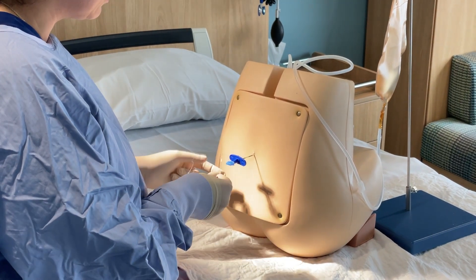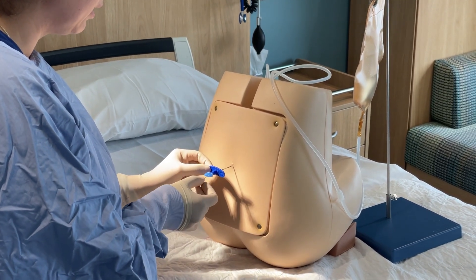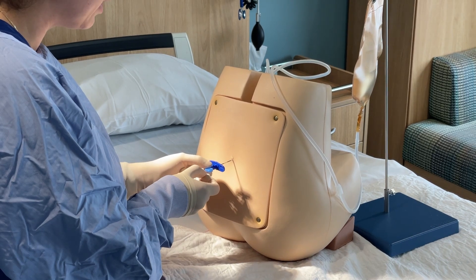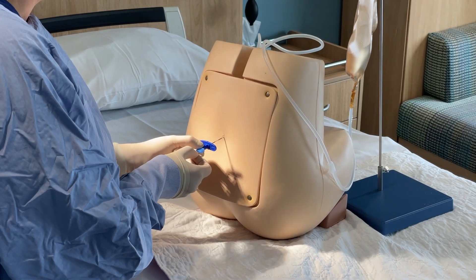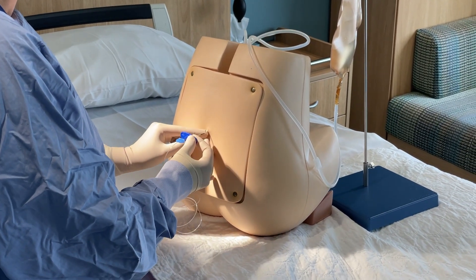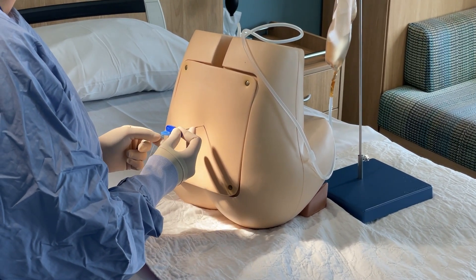I'd like four centimeters in the space, which means the catheter should be at least eight and a half centimeters in. The patient should stay still while you thread the catheter — it should thread easily. If it doesn't, there's likely an issue. Avoid threading catheters during contractions, as this can increase the incidence of intravascular placement. Warn the patient they might feel an unusual sensation — what I call a 'zing.'